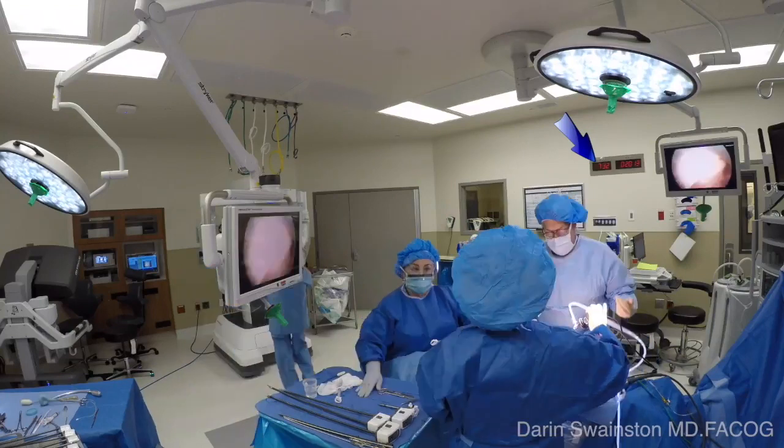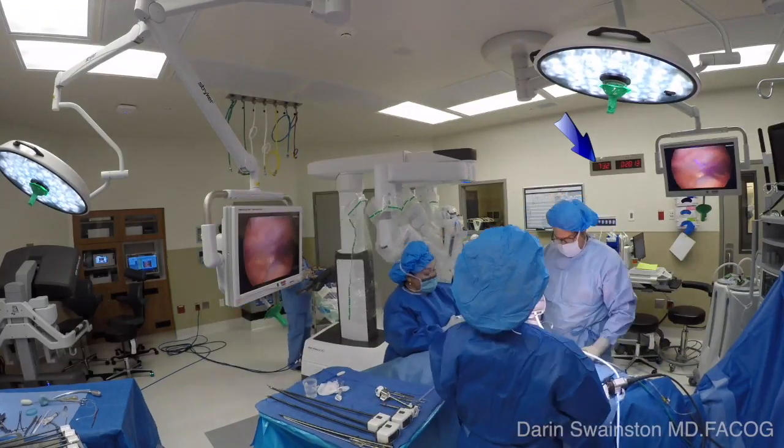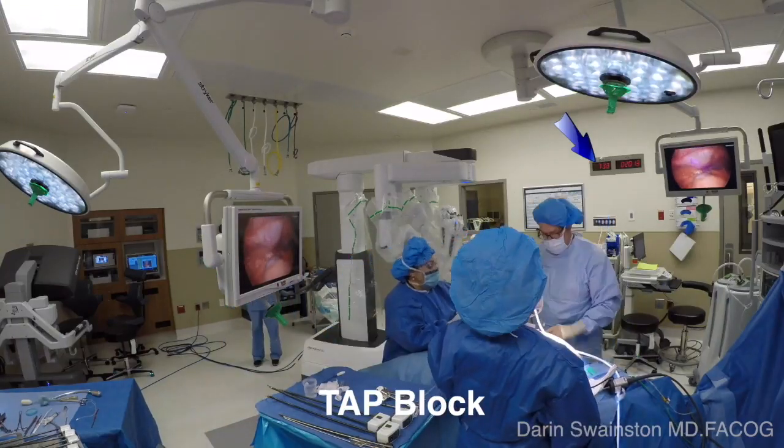Notice the blue clock on the wall showing the time. At the bottom of the screen, I'll show you another time as well. Notice the nurse behind me is preparing the XI to bring it in when I'm ready.